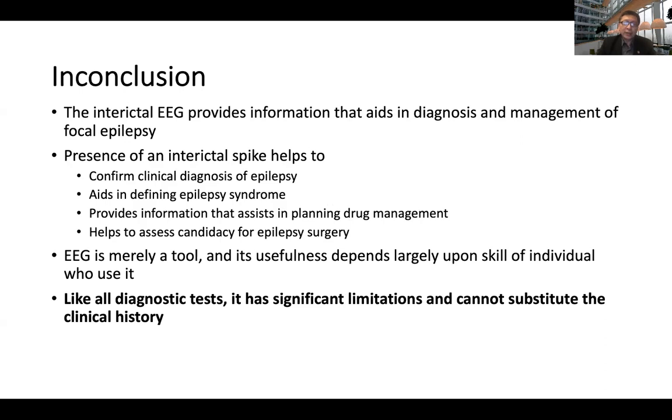The interictal EEG provides information that aids in the diagnosis and management of focal epilepsy. The presence of interictal spikes helps to confirm the clinical diagnosis of epilepsy. It can be used to aid in defining epileptic syndromes, providing information that assists in planning drug management. It can be used to help assess candidacy for epilepsy surgery. However, EEG is merely a tool, and its usefulness depends largely upon the skill of the individual who uses it. And this is also the final take-home message.